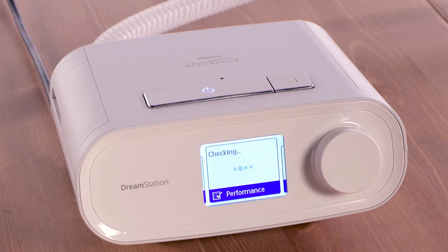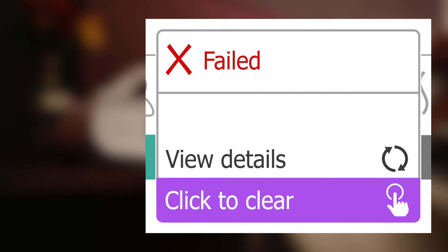If it identifies no issues, a check mark and 'Completed' will appear on the screen. If an X and 'Failed' screen appears, the device should be returned for service.